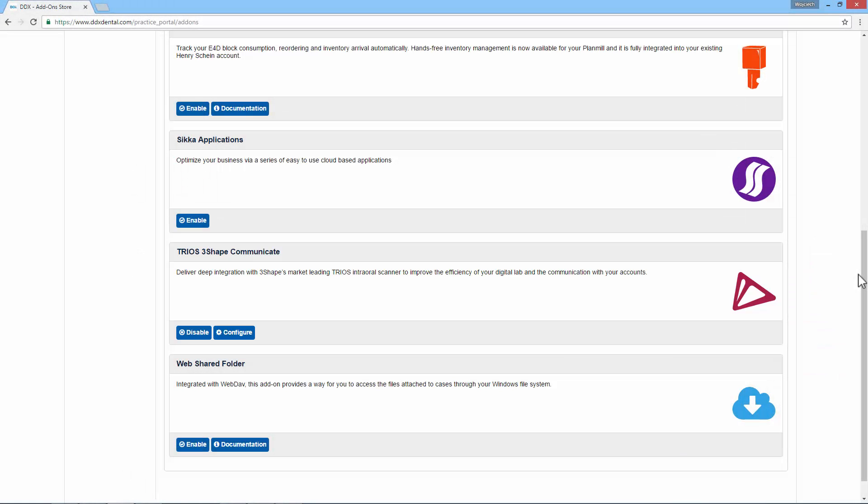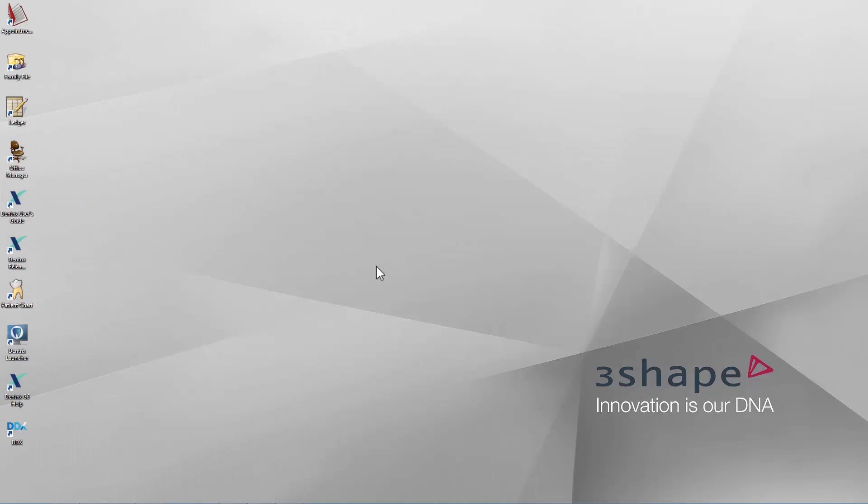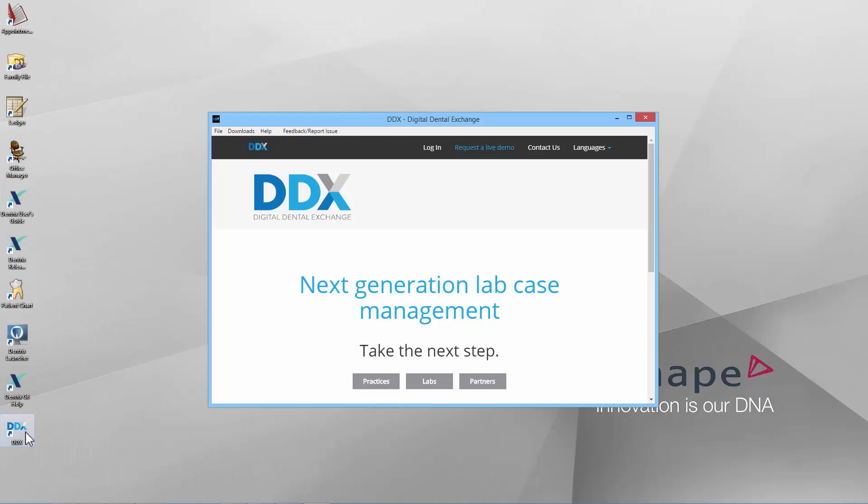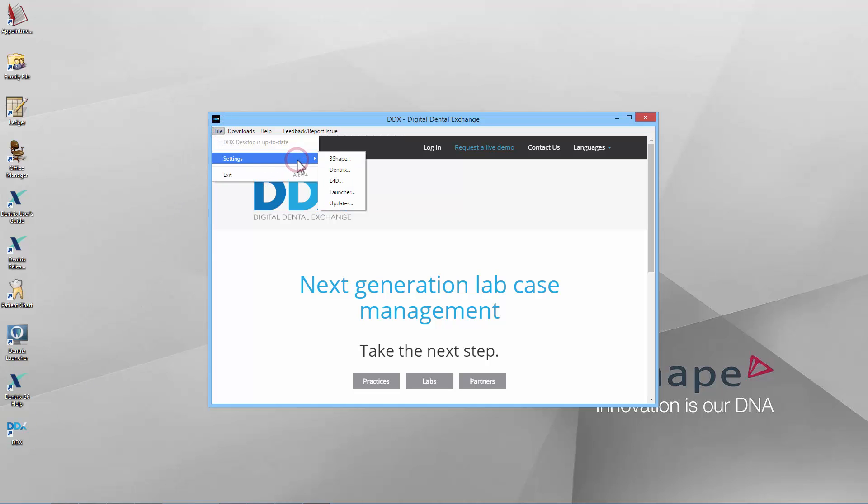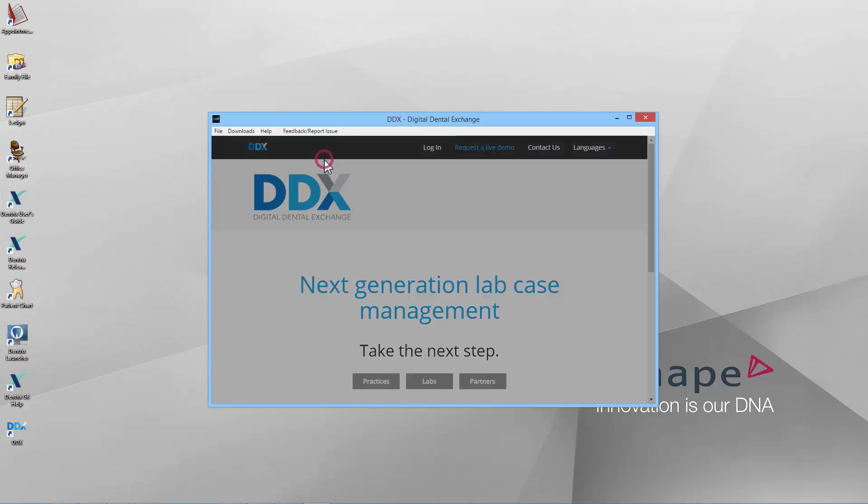To complete the integration and also to transfer case information for in-house cases, launch DDX, select File, then Settings and 3Shape.